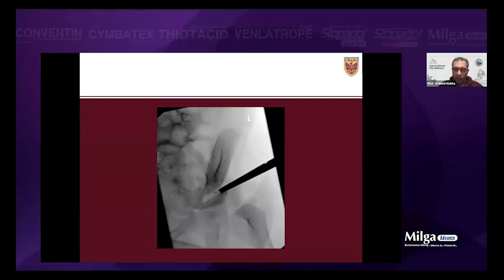When we do the DEGA osteotomy, I go a centimeter above the edge of the acetabulum. Some people go a little bit lower, close to the acetabulum. Just be careful going close to this edge because you have the secondary ossification centers here, and this might affect the remodeling. That's why some people wonder why, after a very good DEGA, the patient had a recurrence and the acetabular index went back high. So just don't go too low.